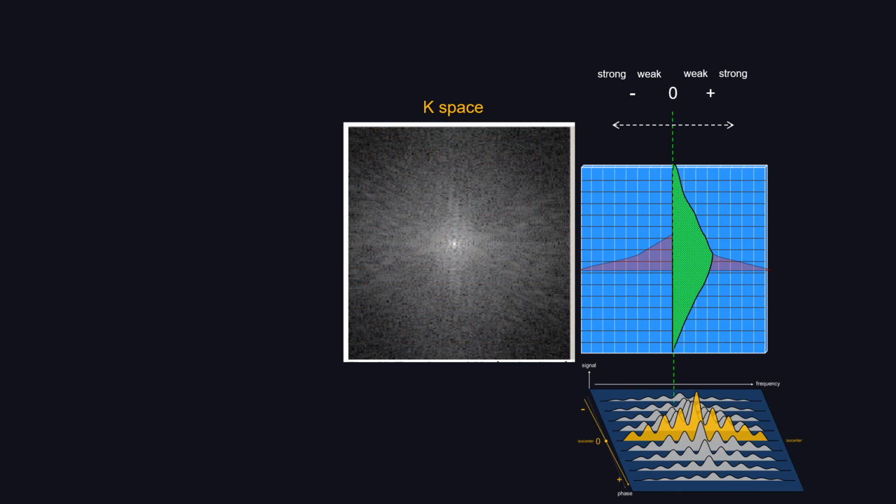Notice that the shape of the echo is such that the signal magnitude is the highest at the center, which is the peak of the echo on the x-axis. On the y-axis, the phase encoding direction, the center line represents the group of protons that sees zero gradient or zero phase shift, therefore also has a higher signal magnitude in the center row. So in the center of the K-space, you are going to see the brightest signal. In contrast, at the periphery of the K-space, you will see the lowest signal intensity.